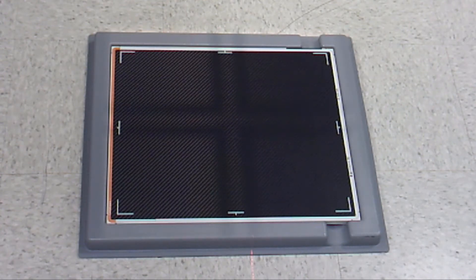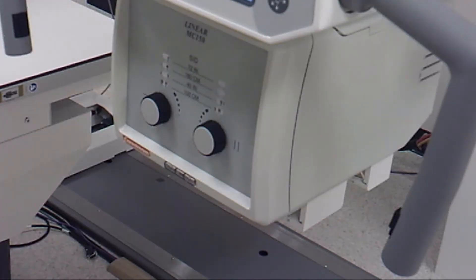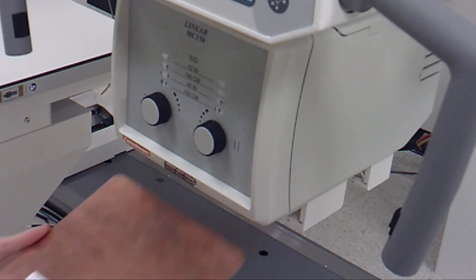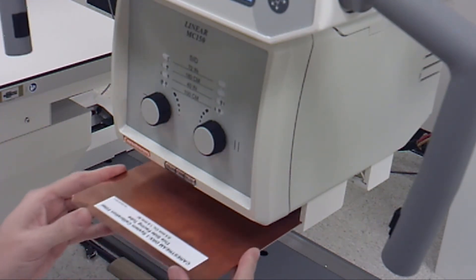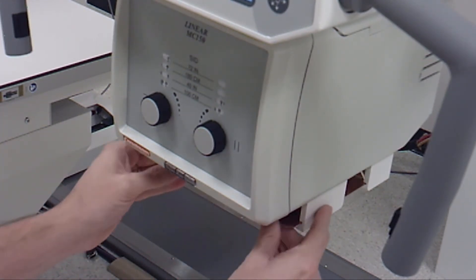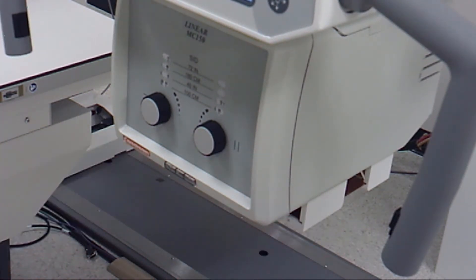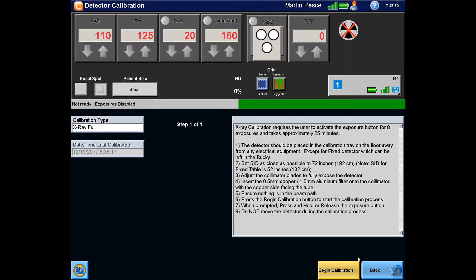Insert the copper aluminum filter onto the collimator with the copper side facing the tube. Ensure that there is nothing in the beam path such as a lead marker that may have been left on the detector.